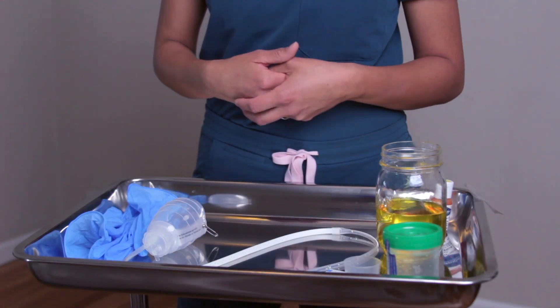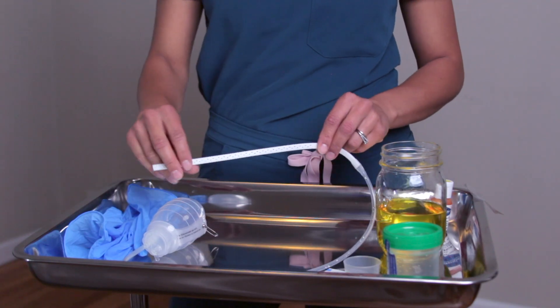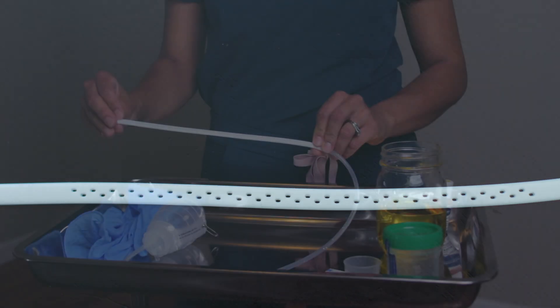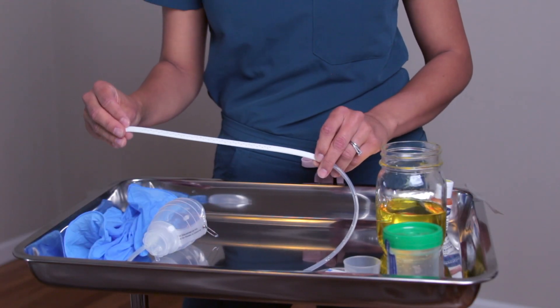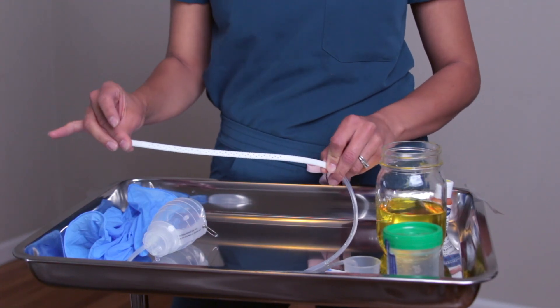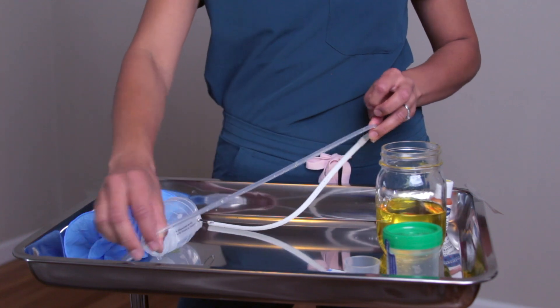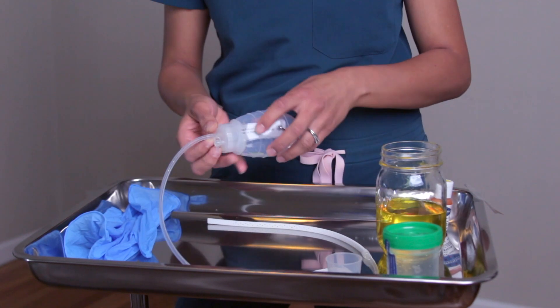The parts of a JP drain consist of your fenestrated tubing with drainage holes. This is actually interesting to look at because a lot of the time your patients that come out of surgery already have the JP drain with the suture attached to it, so you don't see this part. This is what it looks like. Attached to this is your drain, which attaches to your port.